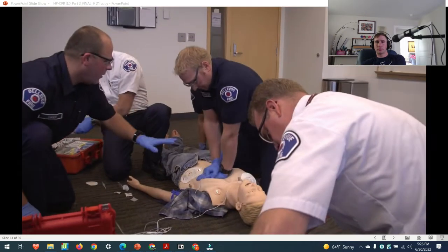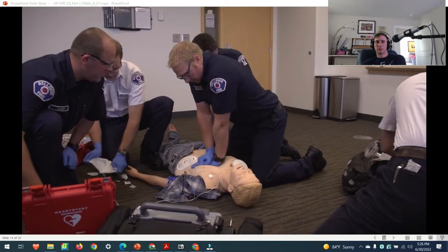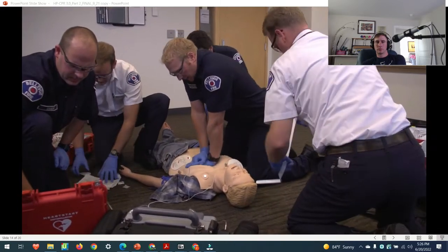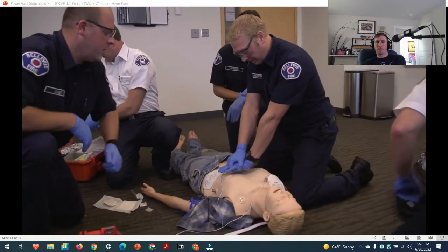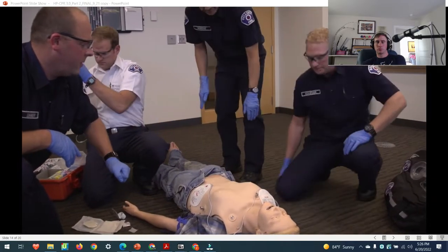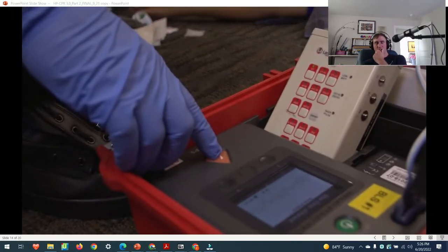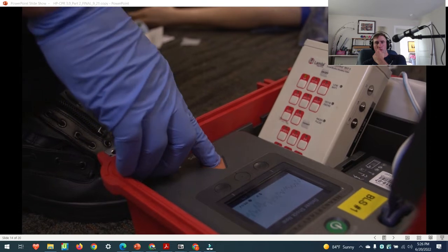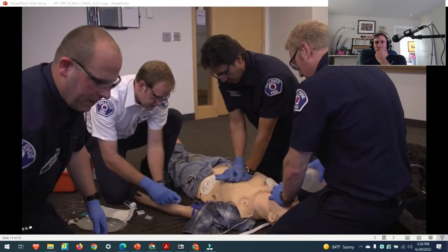Remember, we'll hover while we analyze. 26, 27, 28, 29, 30. Okay, clear to analyze. Clear of patient. You want to hop out, Andrew? Stop device. Stay clear of patient. Hover. Deliver shock. Continue. Okay, we're going to switch over to your machine. Yes. Going for the VTI. Okay.